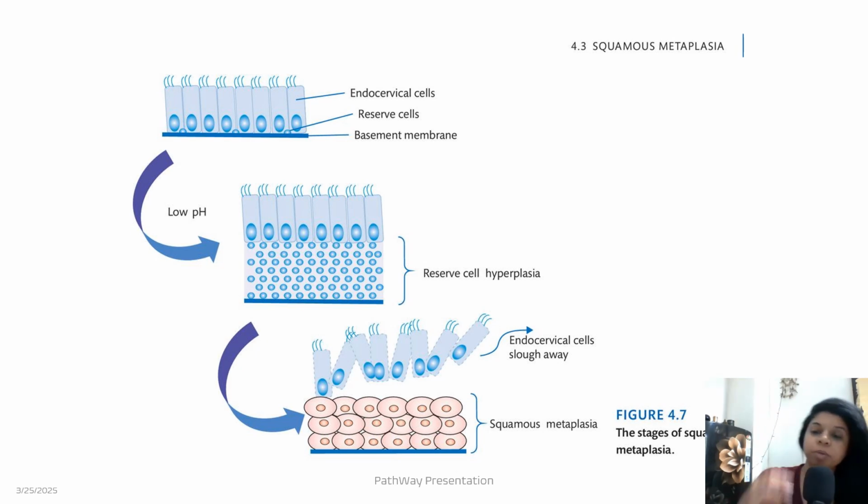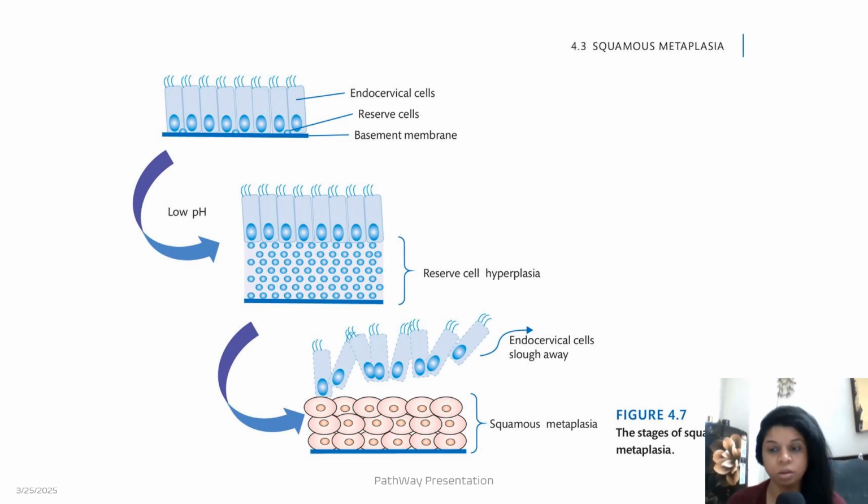You are getting a parabasal kind of architecture or a metaplastic or endocervical kind of architecture. So this is a picture which I want to show you. What do you think when a squamous metaplasia occurs? When I ask students, I have heard some answers like the columnar cells get converted into squamous cells. So this is not the scenario of what is happening, okay?